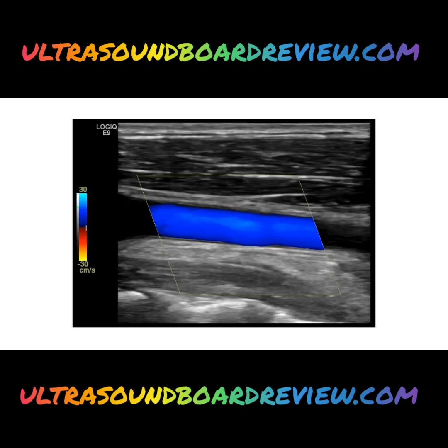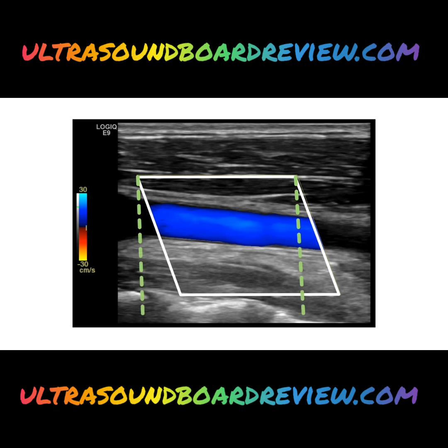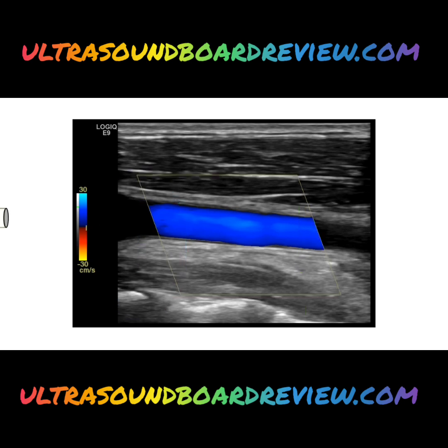Here we go. Same image, inverted. We're going to see how this changes our flow direction. So we have a blue vessel, and blue is on the top of our color box. And we know that anything on the top is going towards the transducer. So let's figure out where our transducer is. Here's our color box. We're going to locate the two top corners of our color box. And now let's draw our line straight down from those corners. Which line is falling outside of the color box? This one. So that is the side that our transducer's on.